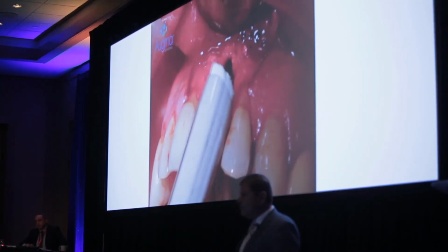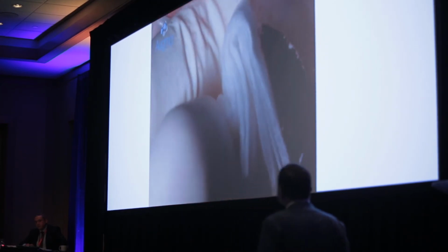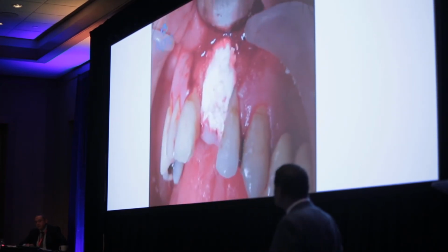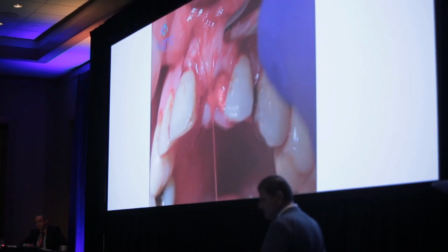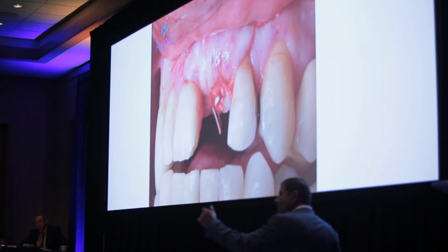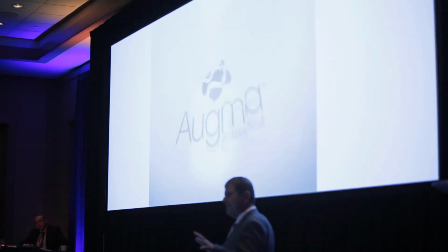Activate the material. You must work with it simply as we show you. Don't complicate it. Eject it to the site, press it firmly for 3 seconds, not more than this, and close your flap. You see that the blood is coming inside due to the hygroscopicity of the material. Now, if you have an opening of 2 millimeters, it's okay, but don't leave it open more than that. Don't leave it 5 or 4 millimeters.